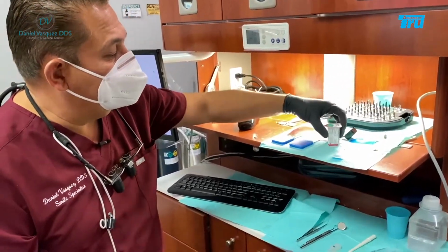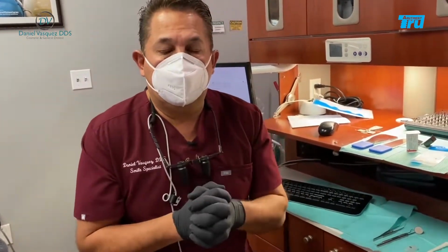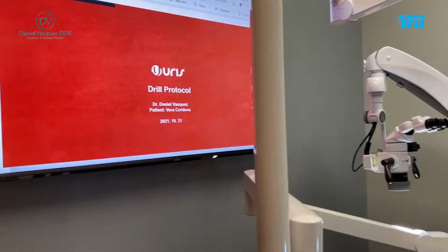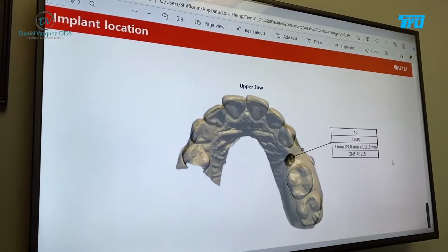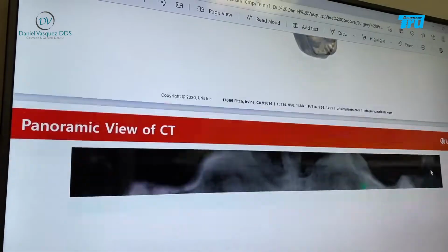Now we have the implant. But what is the depth and everything that we need to do, the protocol for the implant placement? Well, URIS has a drill protocol that is on my screen right now. I'm going to scroll this down. This is for my patient. This is the implant location. We're going to be using a 4.0 millimeter by 11.5 implant. That's the size of our implant.